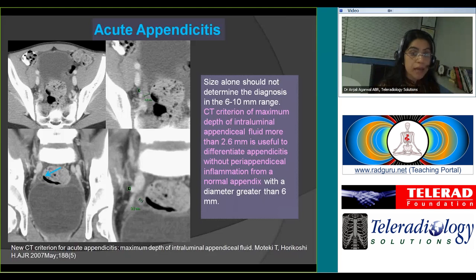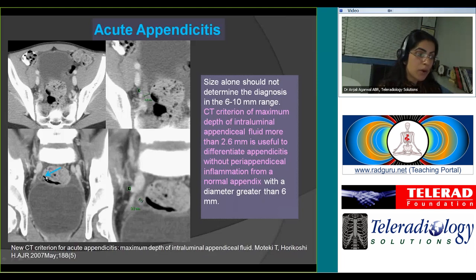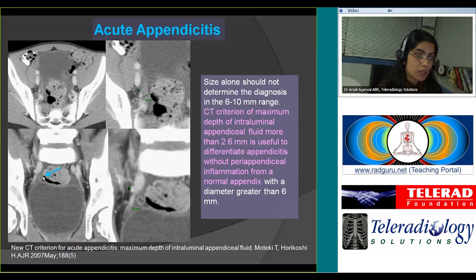You can distinguish appendicitis from a normal appendix — which can often also be greater than 6 millimeters — when the size is just borderline at 6 to 10 millimeters and there is no fat stranding. In that case, use the CT fluid depth criterion of greater than 2.6 millimeters.